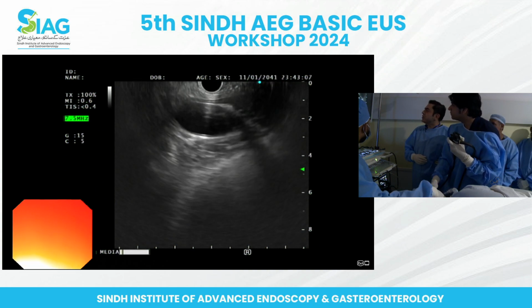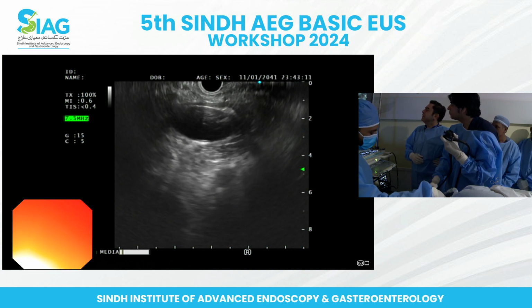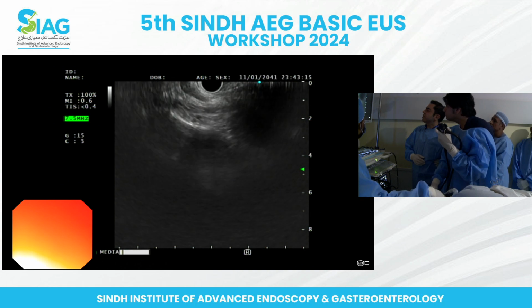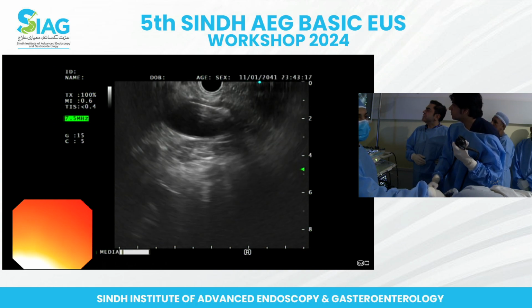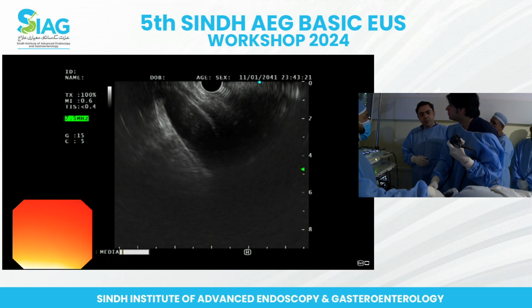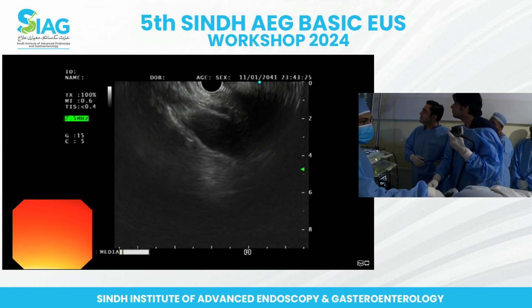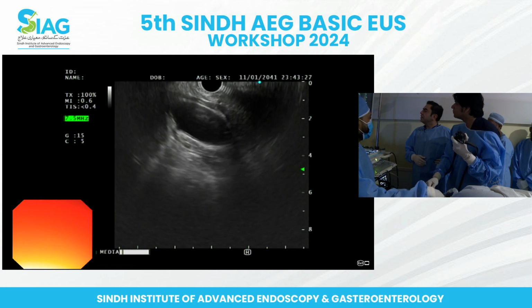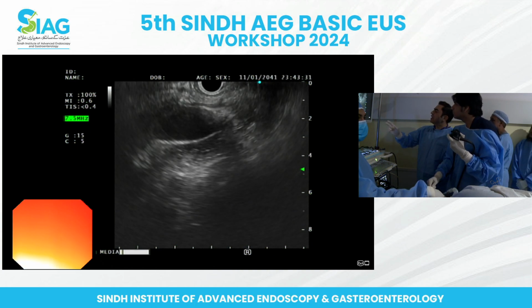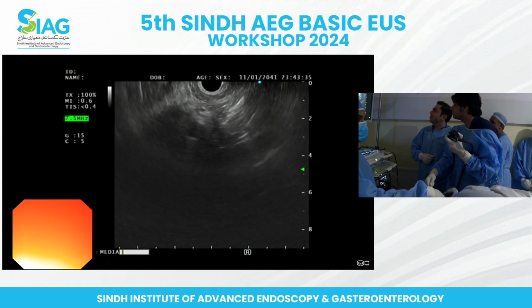So we're just trying to get the aorta in position. We had a look at the left adrenal as well. So Dr. Afan can demonstrate that again if you just put the scope in a bit. Excellent. So I think you probably are using the wheels. That's why the position is changing. It may sometimes happen as well if you're in a hernia. So pull the scope back a bit again. Yeah, try. Excellent. So we're getting a better position of the aorta. Pull the scope back. Excellent.